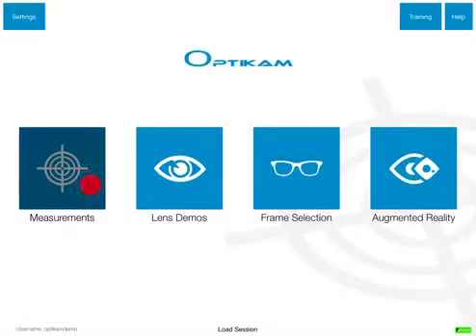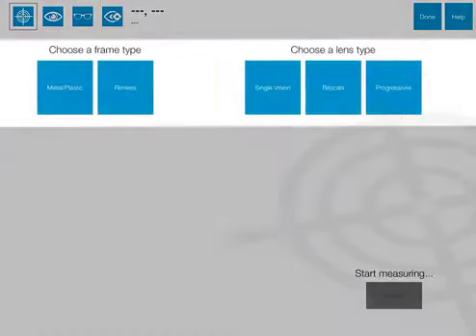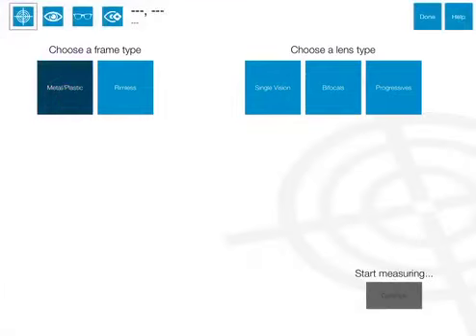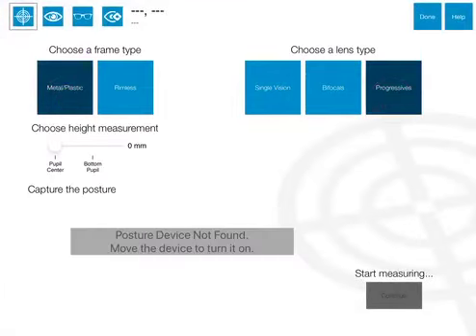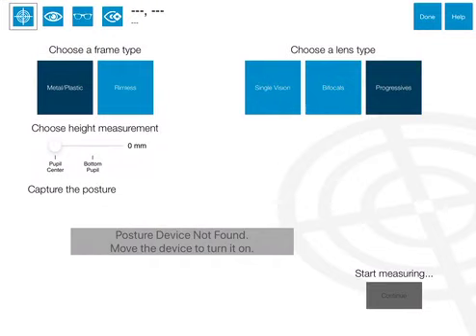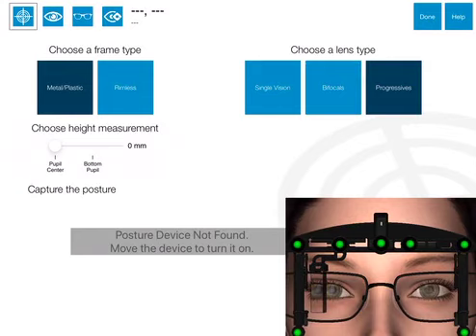Start the measurement process by selecting the frame type and the lens type. Selecting the metal plastic frame type will add 0.5 millimeter to the fitting height measurements to account for the bevel. Next, connect to an OPD that will be used in the measurement process.